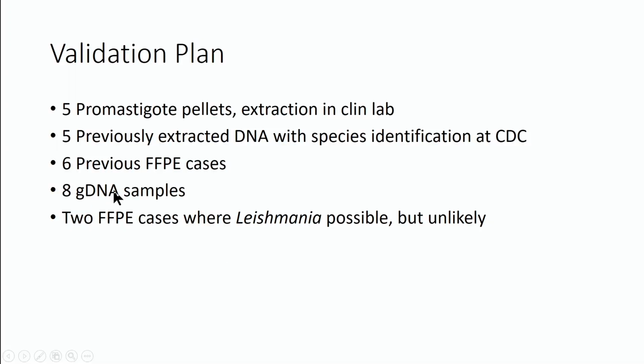And then we have a number of FFPE cases where we weren't able to identify a Leishmania organism, but it was identified at the CDC in that specimen or in another specimen for that patient. We still have some residual genomic DNA samples that we have extracted, and then there are 2 FFPE cases that I've seen recently where Leishmania cropped up in the differential, but I will be shocked if that's what it is, and so I want to know.